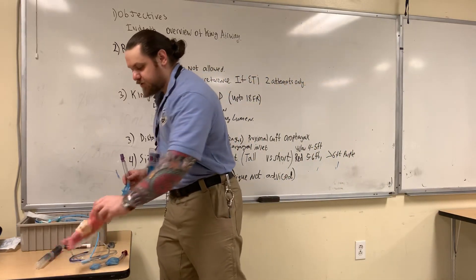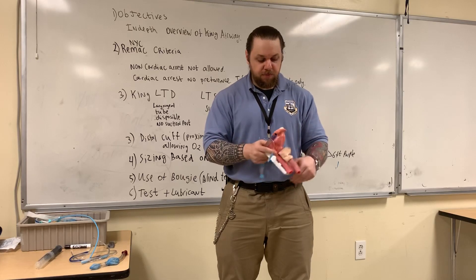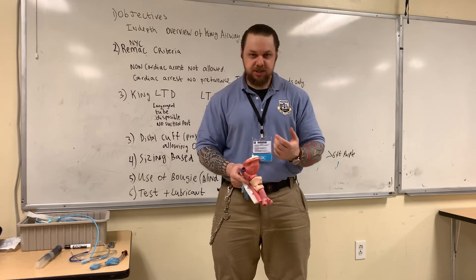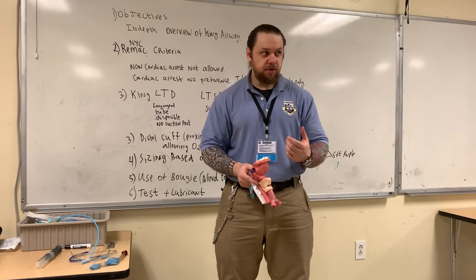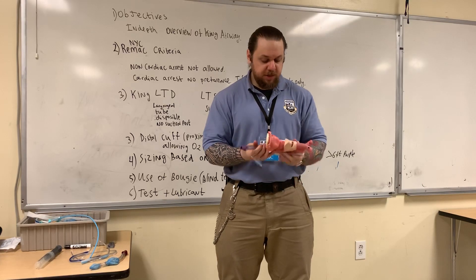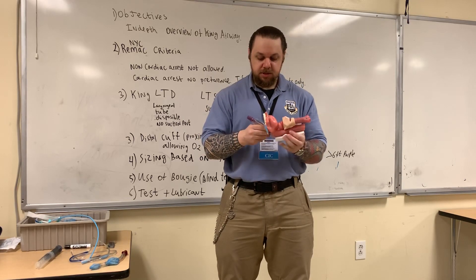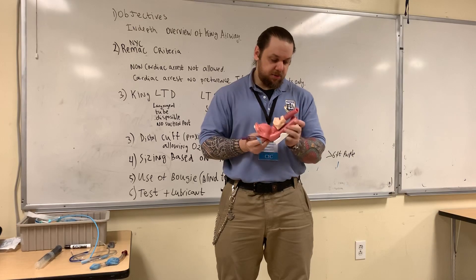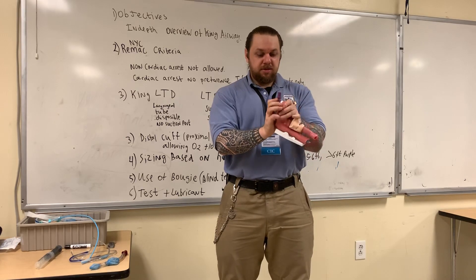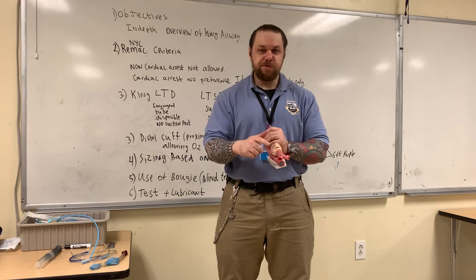The manufacturer advises that you perform a tongue-jaw lift toward the ceiling, or you could use a blade to facilitate that if you're worried about the patient biting your fingers. Then you're going to insert this device all the way down until the connector is aligned with the teeth. Once the connector is aligned with the teeth, go ahead and inflate your cuffs.